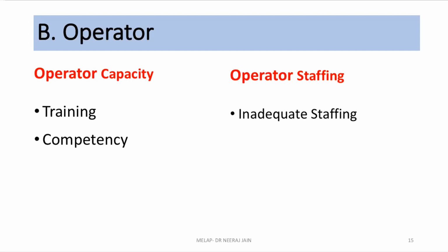This logistic issue, we have to guide your clinicians, nursing staff, residents, because they are performing other activities also. So with that, sample collection shall not be neglected. You have to discuss with them, and they shall be trained to collect various types of samples, because your result is only as meaningful as the quality of the sample collected.